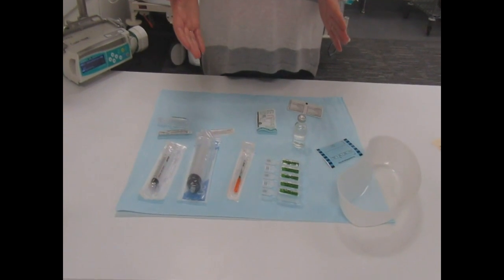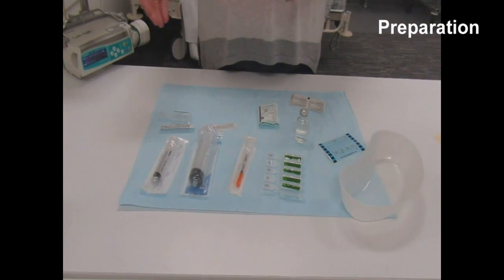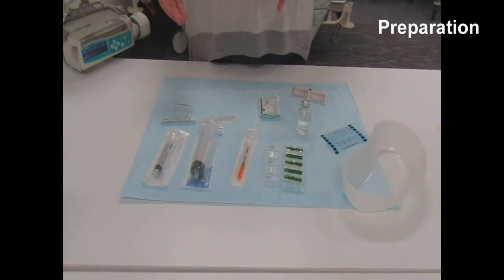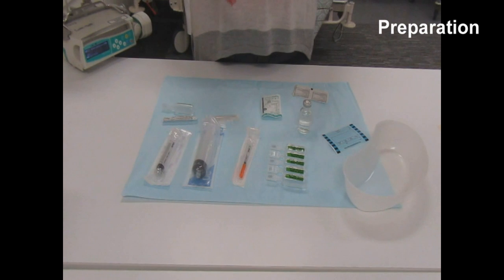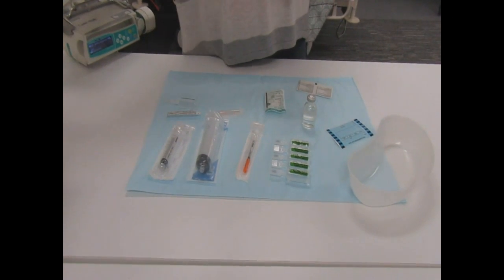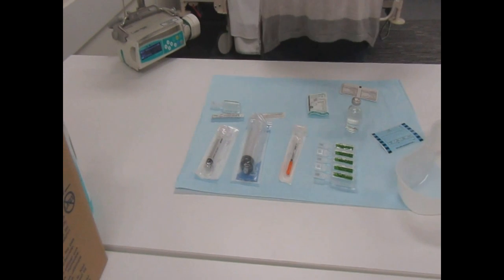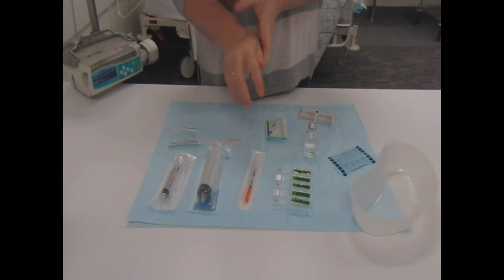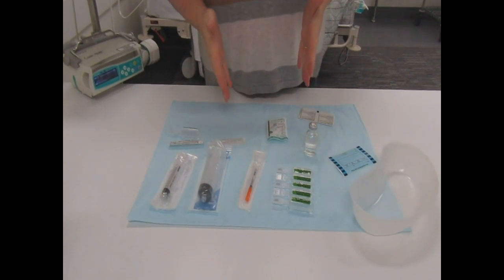We're putting our insulin infusion together for our patient because of his history with diabetes and his current medical state. Before I start, I'll put some gel on or wash my hands, depending on the facility's policy, and then start prepping my equipment.